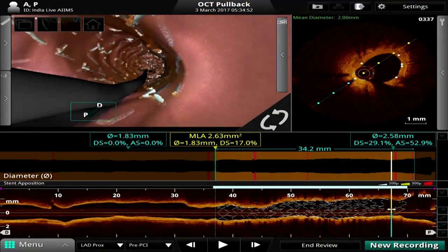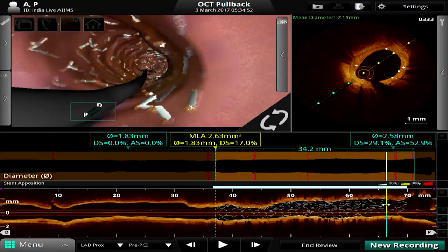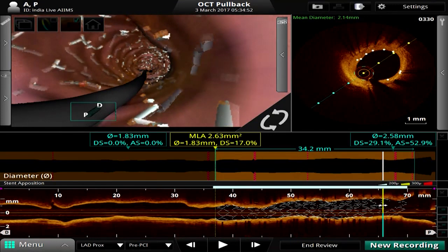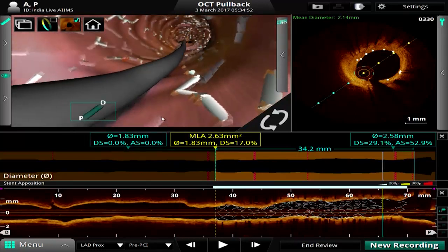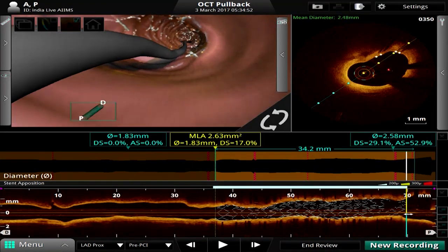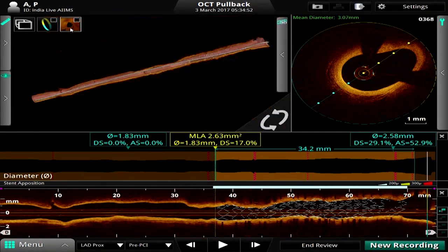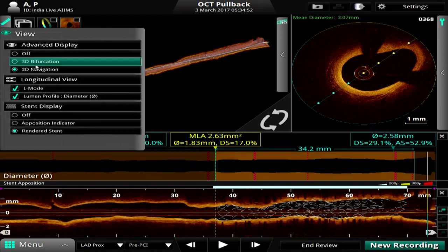Dr. Bahl, I saw from the OCT that there was a smaller stent diameter, maybe because of stent undersizing. And second, can you show from the angiogram that there is a significant stenosis? Because on our screen I couldn't see clearly the left main to LAD, except the ostial circumflex. Dr. Wong, also take note of that. That's right. That tight lesion is in the left circumflex.